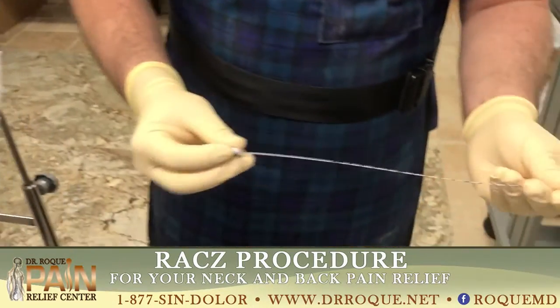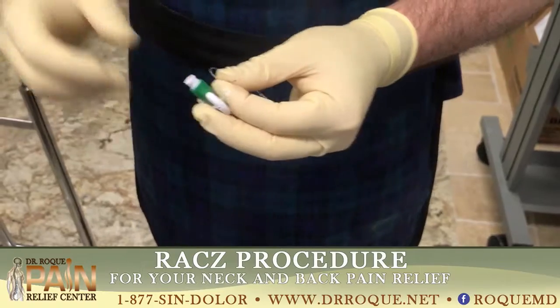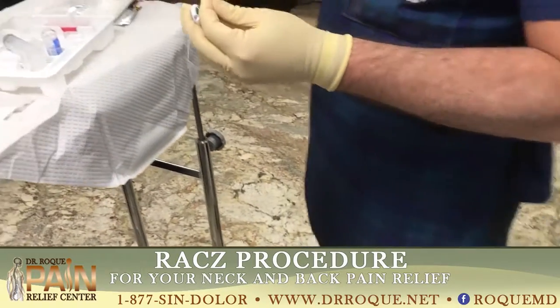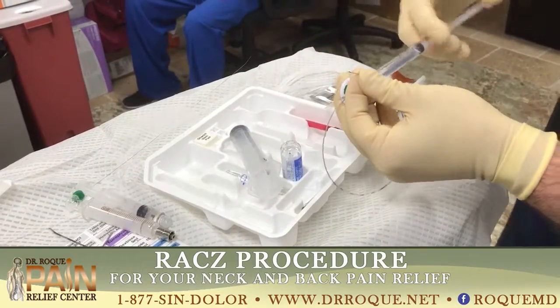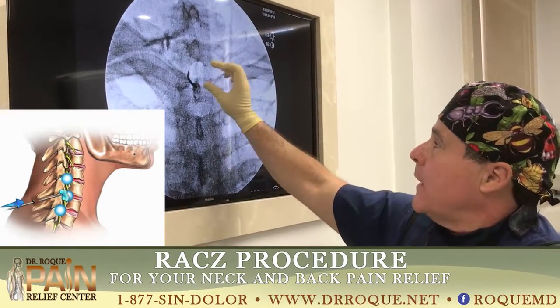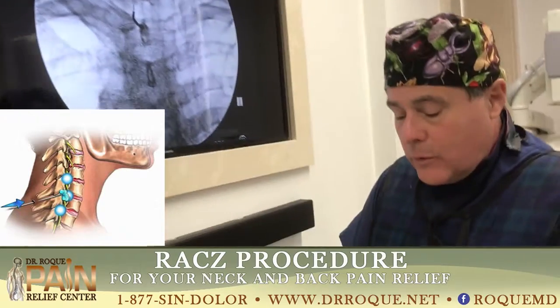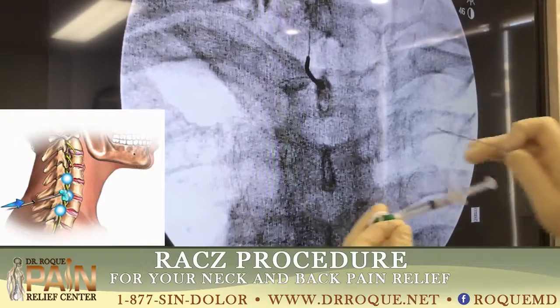Using a catheter, as you can see here. It's a very simple catheter, but it's able to get the medication where you need it. The medication goes right through a port, right here, and it actually comes out — let me squirt it out so you can see what I'm talking about. This is just a sample. What we're seeing here is the needle entering between the vertebra T1 and T2, and through that same needle there's a little cable that's moving here. The medicine enters here and comes out here.